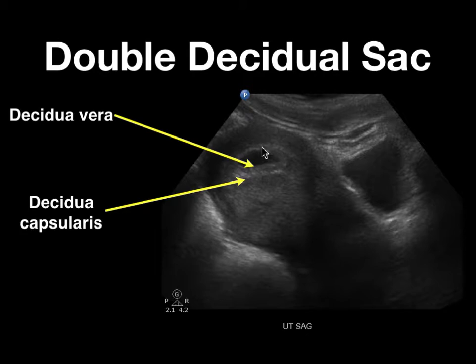So clinicians and researchers looked for ways to better understand the appearance of the intradecidual sac and to see if there were ways that you could definitively call it an IUP before the presence of a yolk sac. And Nyberg felt that this was a highly sensitive finding, that if you saw a double decidual layer around that sac, that went along with an early IUP.